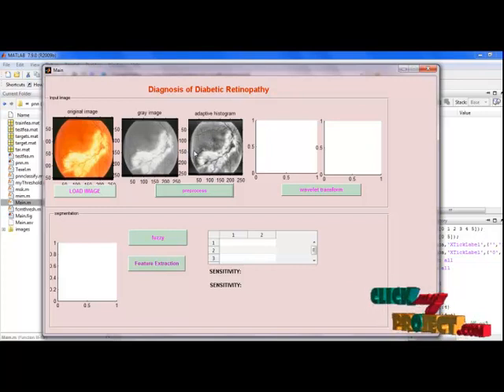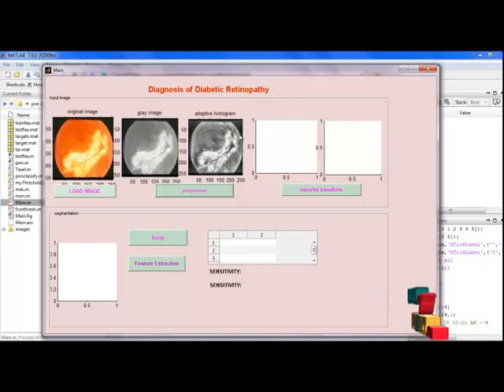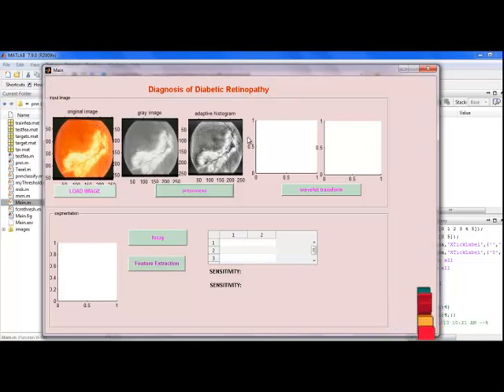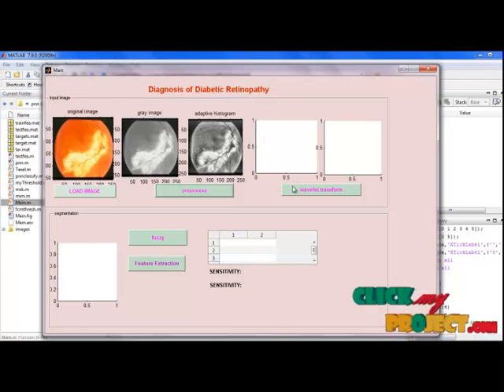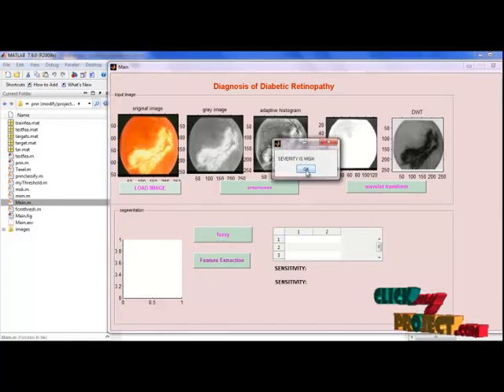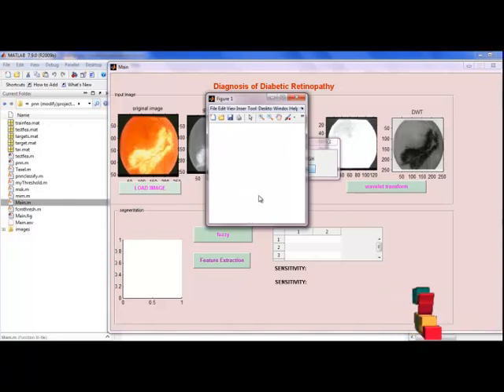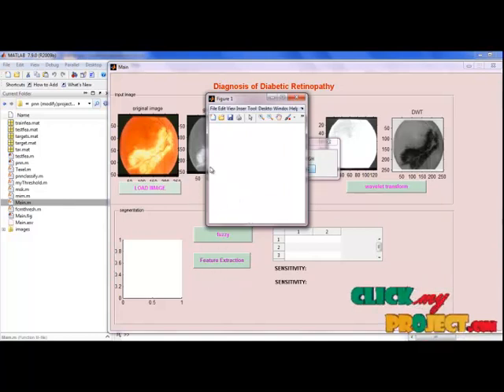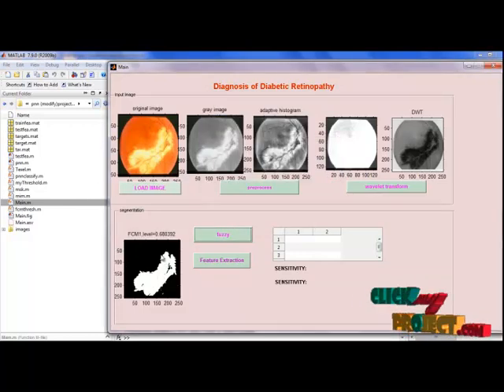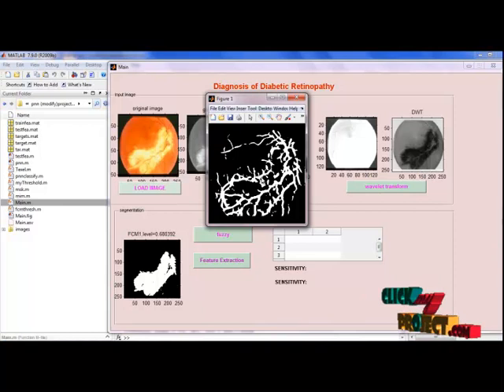Adaptive histogram equalization is used to improve contrast in images. It requires the computation of a different histogram and transformation functions for each pixel in an image. The next step is wavelet transform. Then fuzzy c-means segmentation is applied — severity is assessed. In this process, it finds the grayscale regions from the preprocessed images. Features are extracted for the classification process, providing segmentation of blood vessels.